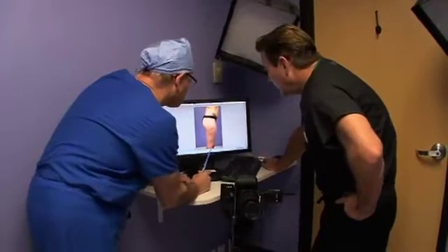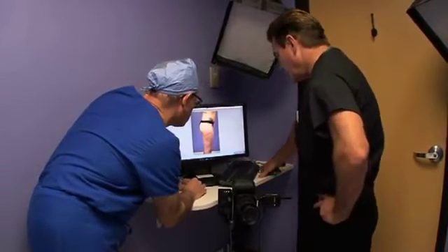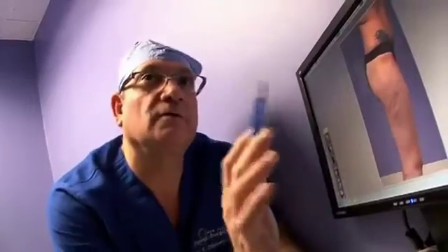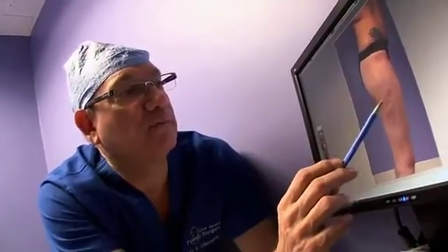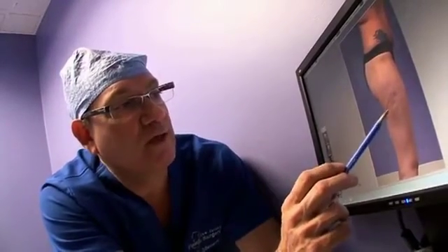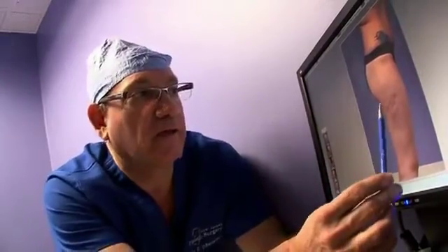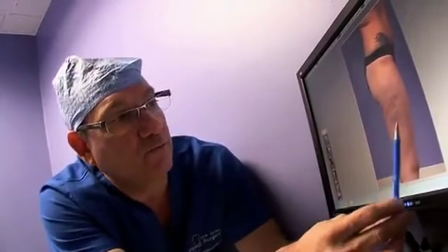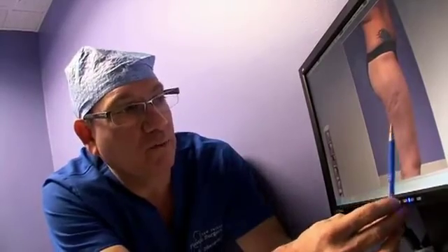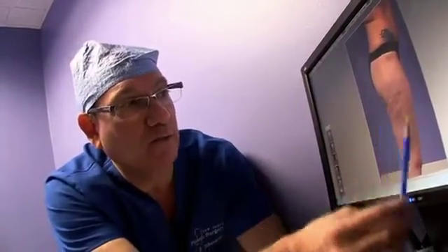She's our first patient, so let's evaluate if she's a good candidate for the Cellulaze treatment. So Grant, you can see that we have these deep depressions in numerous areas. We have hills, valleys. This is considered grade 3 cellulite, and in addition we have a background of more dimpling or mattress pattern. So we're going to go ahead and treat this whole area, but I think we'll flatten that out beautifully. There's some grade 3 cellulite here.